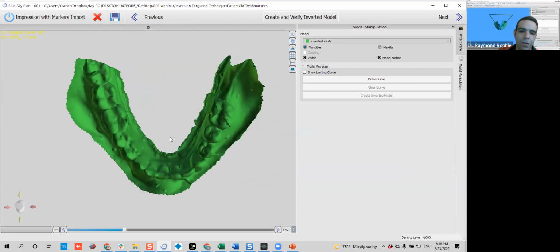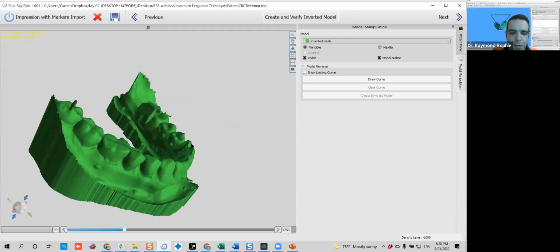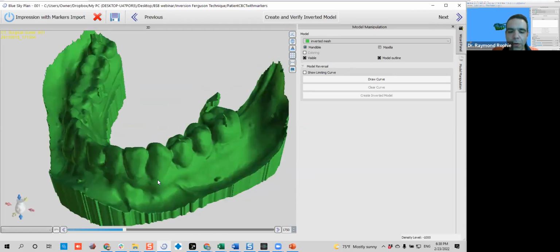Okay, I think that is a great question. So look, if you have an intraoral scanner or a desktop scanner, of course, our images will be much more crisp than this, right? When you're not able to scan because you don't have a scanner, or you have a patient that needs a gagger, or a patient that is just impossible to scan, or the patient is gone but you have a model of the patient, or it's heavily restored with metal and so shiny that the intraoral scanner will not take it, and you don't have a stone model, then that's when you resort to the CBCT, okay?